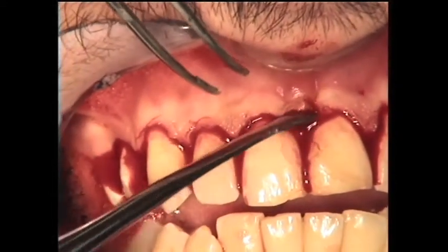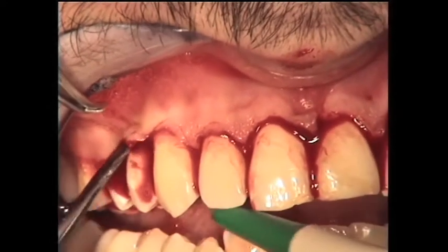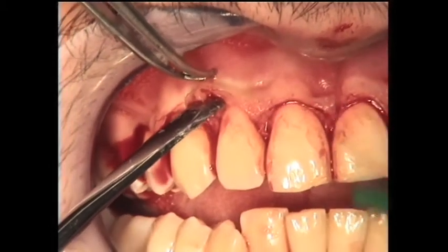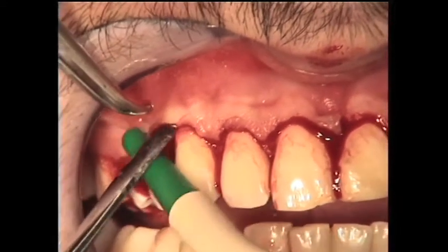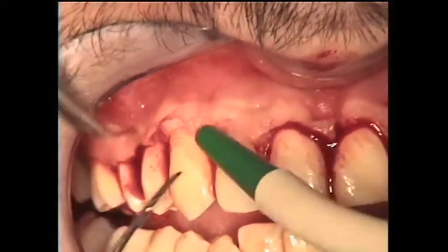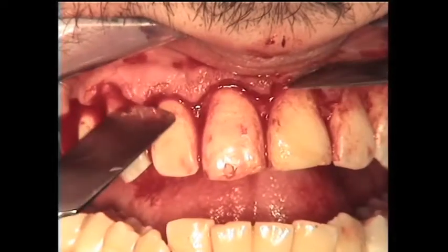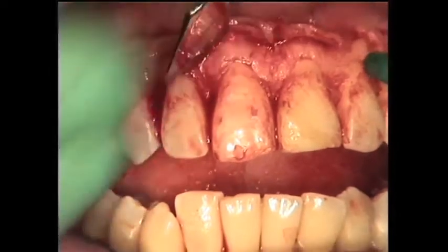After this, we proceed with elevating the flap in order to evaluate the biologic width around the teeth. As we can see in this case, the bone level is located exactly at the cement enamel junction of every single one of the teeth of this patient. For this reason, it will be necessary to perform osseous resective surgery to create 1 or 2 millimeters of gap between the CEJ and the bone crest to establish a new biologic width.